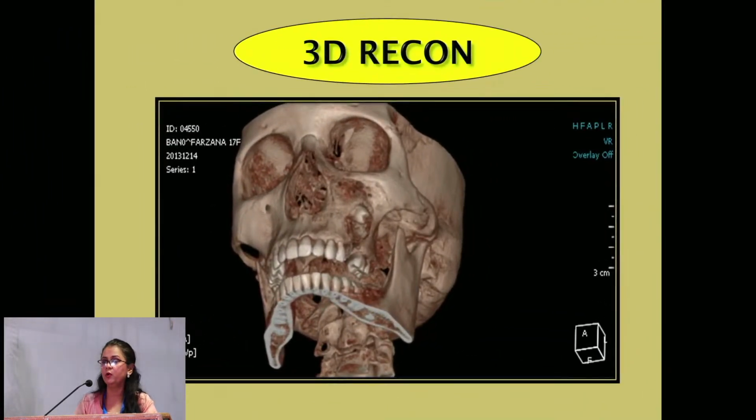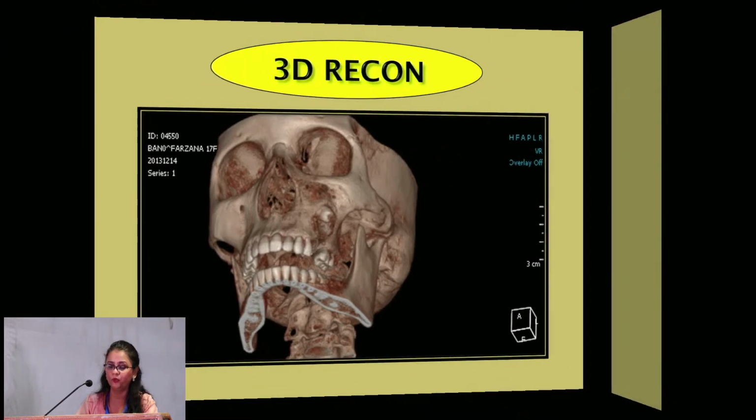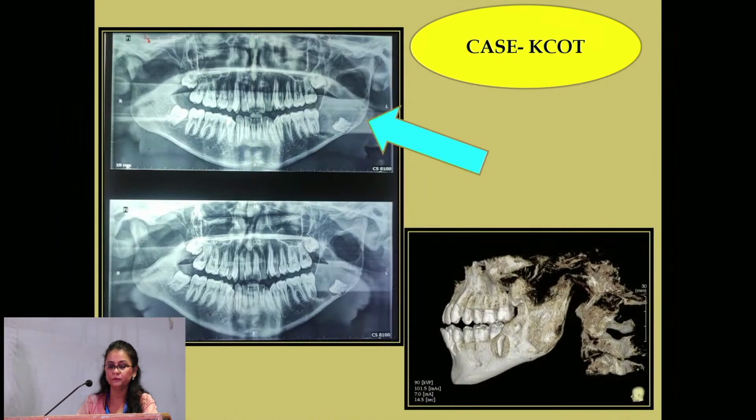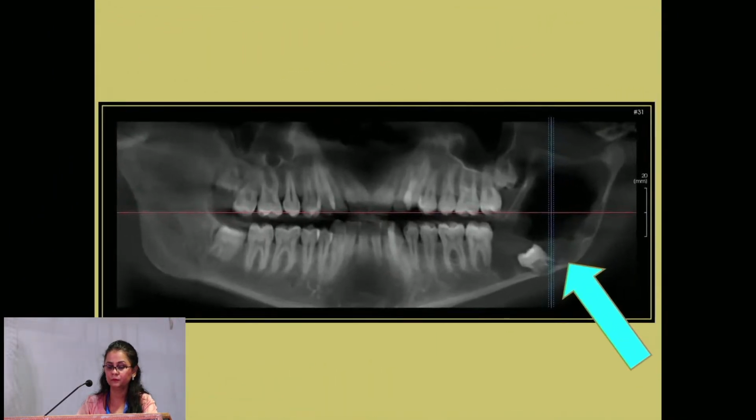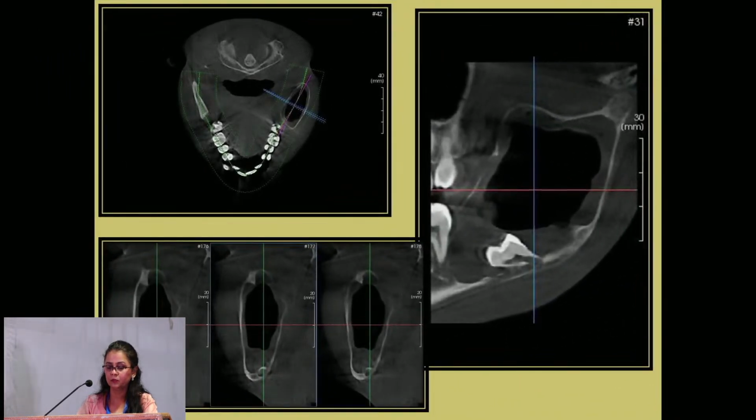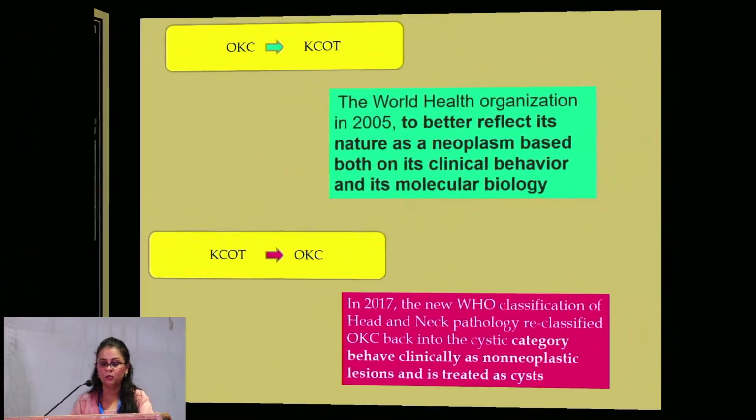This is a full view of the skull, a craniofacial view. When you are expecting, you have an impacted canine or a premolar, you have an involvement of the maxillary sinus or the orbit, go for a larger field of view. So just see the lesion, its varied appearance.